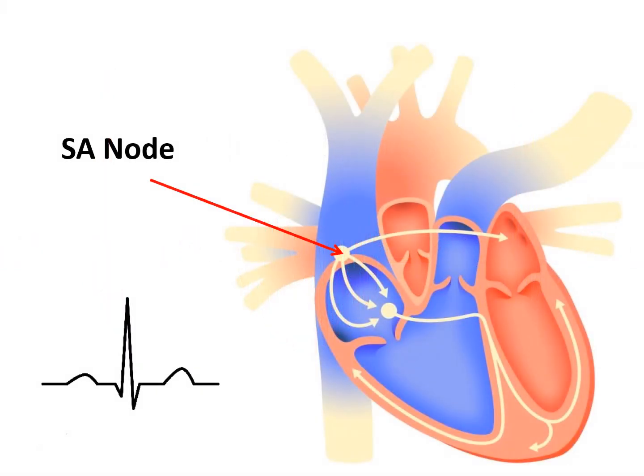The electrical impulse in a sinus rhythm is initiated by the SA node, also called the sinoatrial node, or simply the sinus node. That impulse follows the normal electrical pathway through the atria, causing atrial depolarization and contraction. One key component of sinus rhythms is that they are regular. That is, there is equal time between impulses initiated by the SA node, resulting in a regular, steady heartbeat.